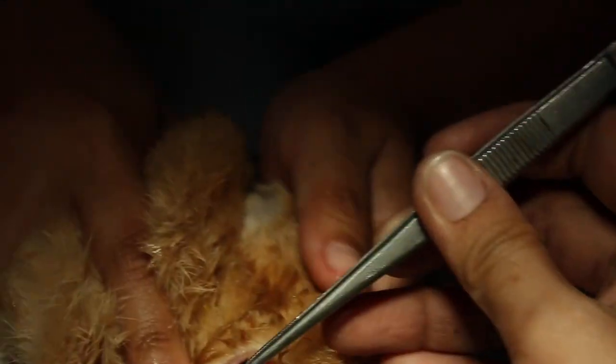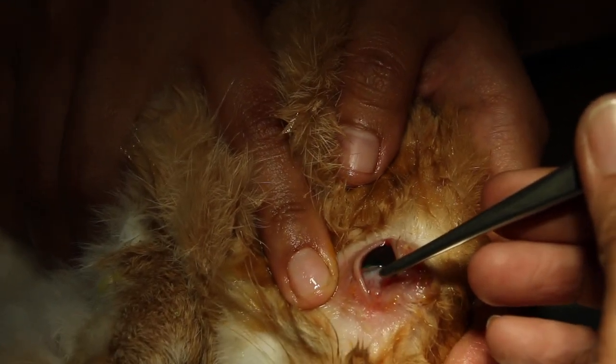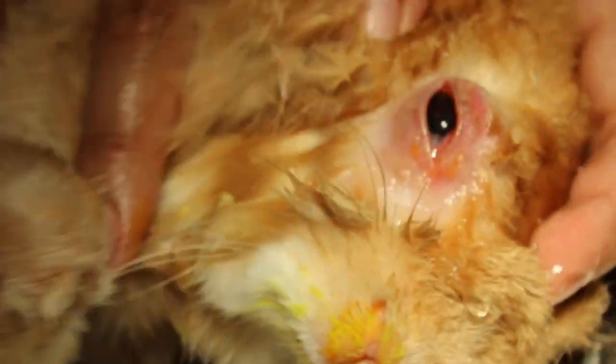One person holds — let's see. Just flush below in case any hair is stuck there. Okay, finish. That's it.